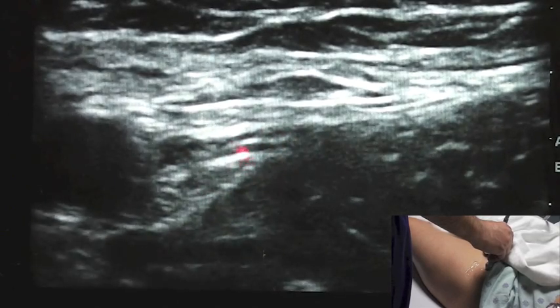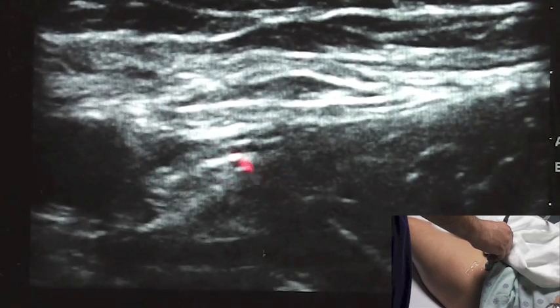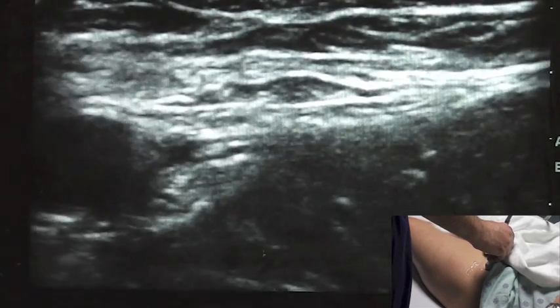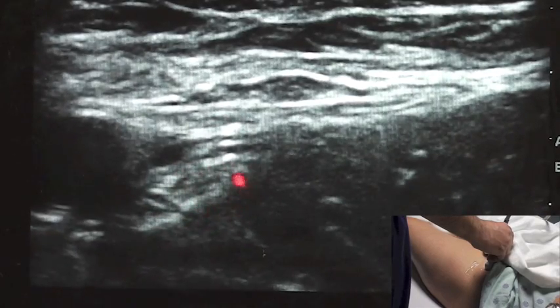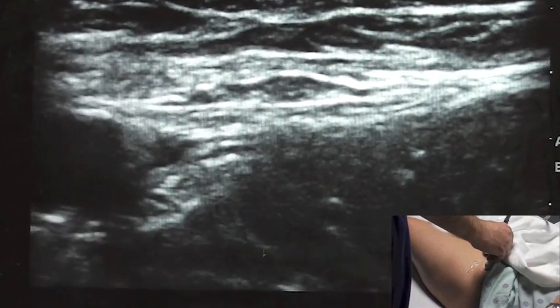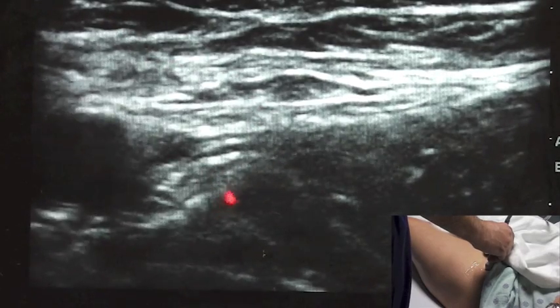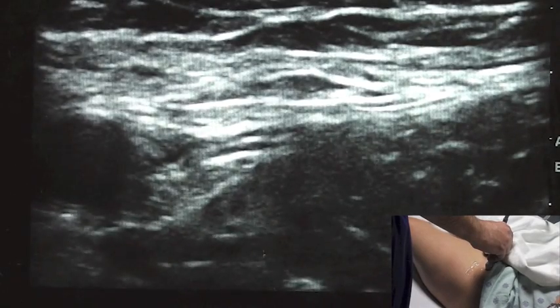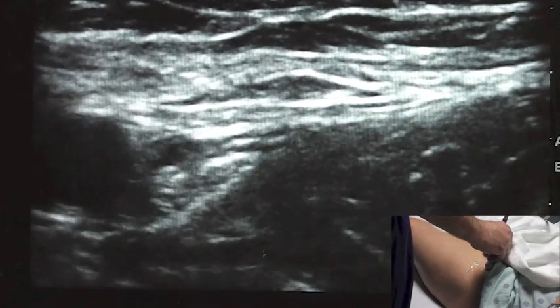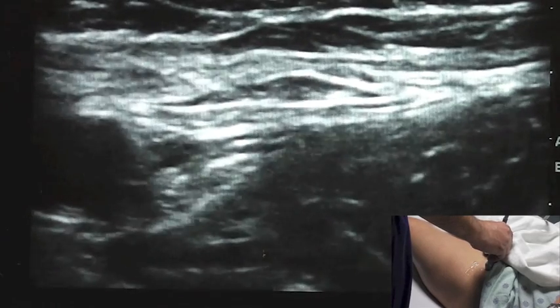I do tend to use nerve stimulators, but when I've confirmed that I'm getting a twitch and I'm near this structure and confirm it's the nerve, I'm more interested in ensuring proper spread on the anatomical view than ensuring I get the absolute best twitch down to 0.4 on my monitor. In total for this block, if we're doing a one-shot block, we would use 30cc's of local anesthetic.